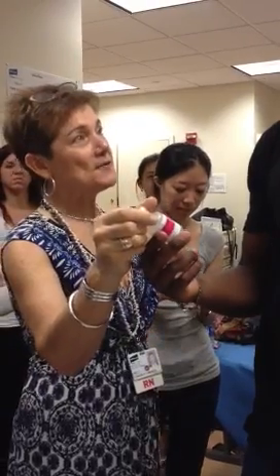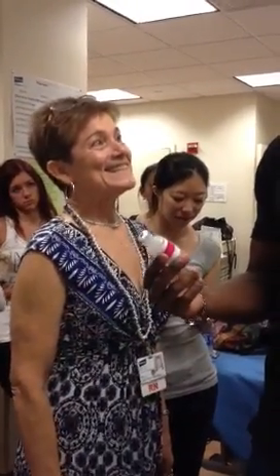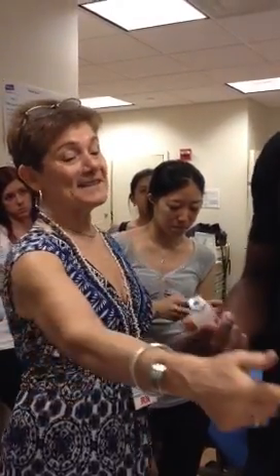If this says 300 in 1 ml, how much would you give? I'm going to give 0.5 mls. So you have to check your bottle to see what's available. It's just hard to pretend. The order is not going to tell you how much you have to give. They're going to tell you 150 milligrams, but you have to see what is provided, what you have available, to determine how much of the actual liquid you get.